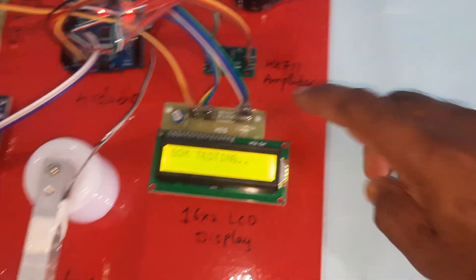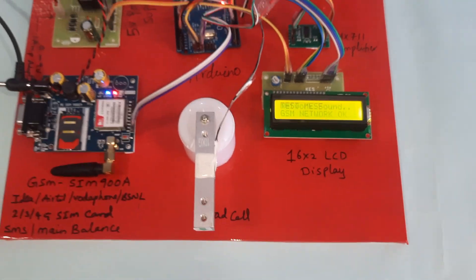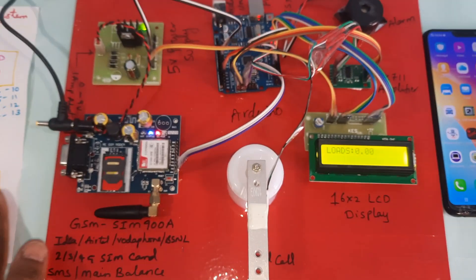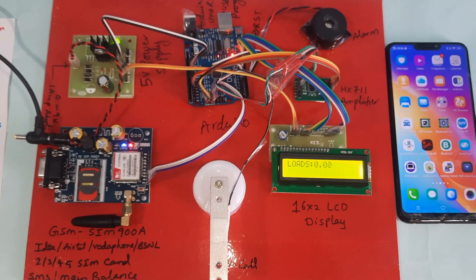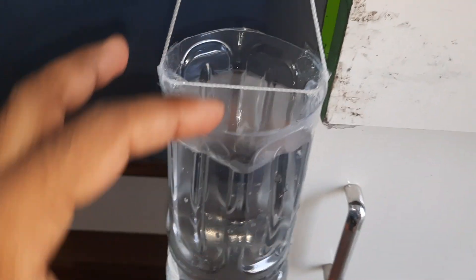The HX711 module and alarm are active, and the GSM SIM card is connected and finding the network. Load reads zero. Now adding water to the bottle — water is full.